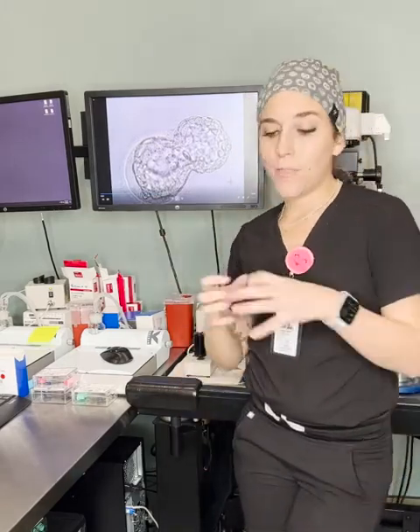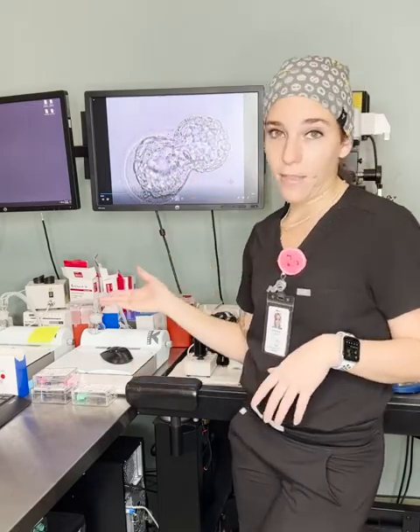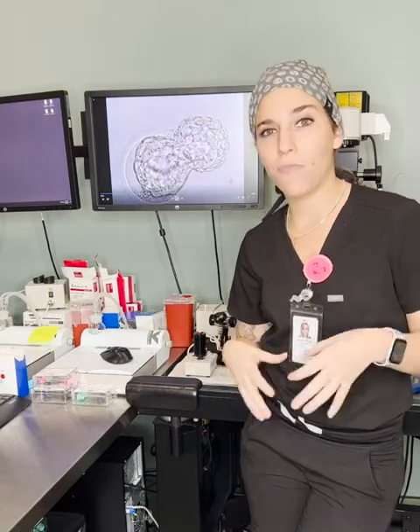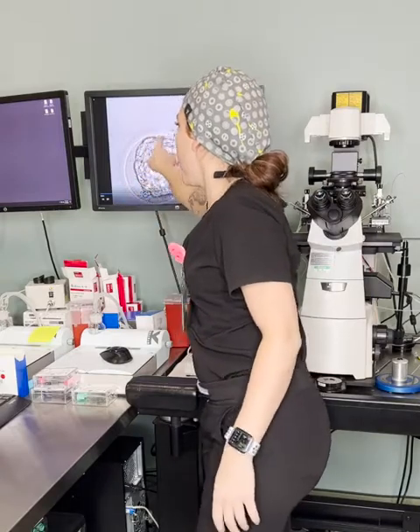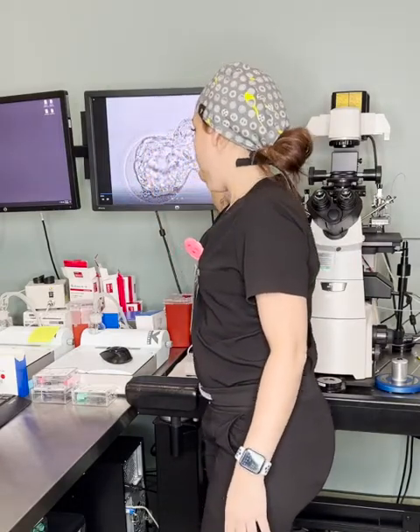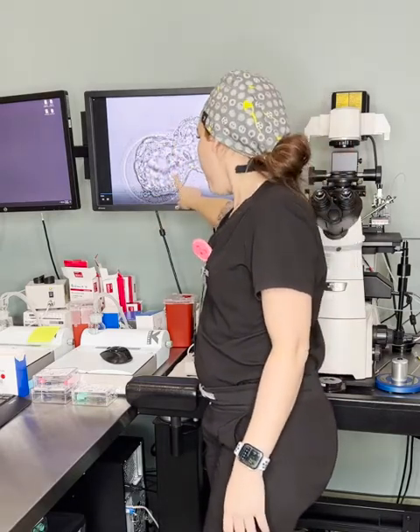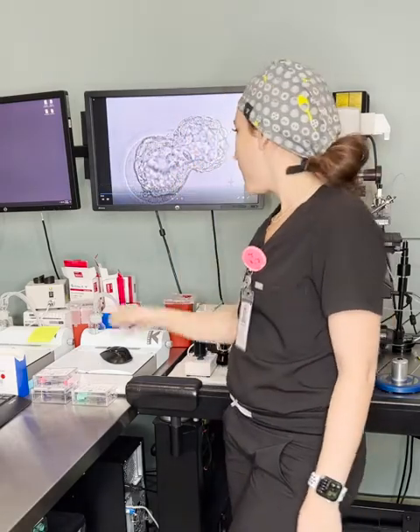When we thaw this embryo, it's going to blow back up like a balloon. In fact, I have a video of an embryo we just thawed and did the assisted hatching on, and afterwards it re-expands and looks just like this, only better. Again, it's not going to kill your embryo, we're not doing anything barbaric, I just wanted you guys to get a feel of how we do this. So, remember, this is the shell, here's the embryo hatching out of the shell, so it does look like two embryos, but really it's just one. The ICM is over here, and the rest of these cells are the trophectoderm.